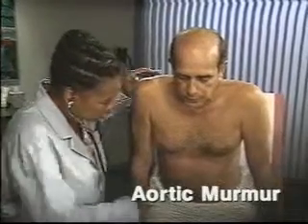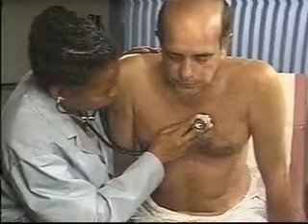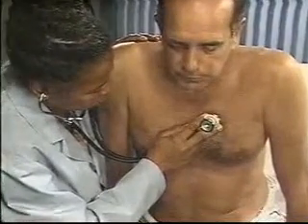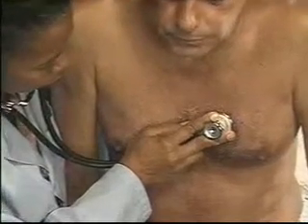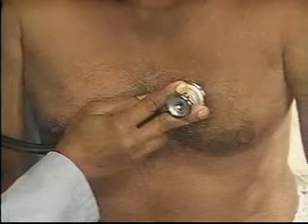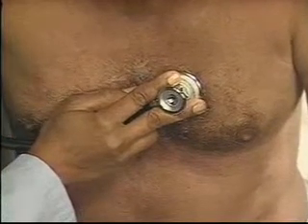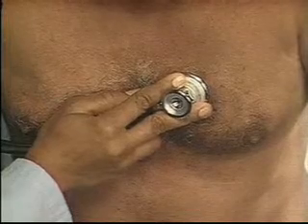To help detect aortic murmurs, especially that of aortic regurgitation, have the patient sit up and lean forward. Then ask him to exhale completely and hold his breath out. Using the diaphragm of the stethoscope, listen at the left second interspace and down the left sternal border to the apex. Breathe out completely again and hold it.